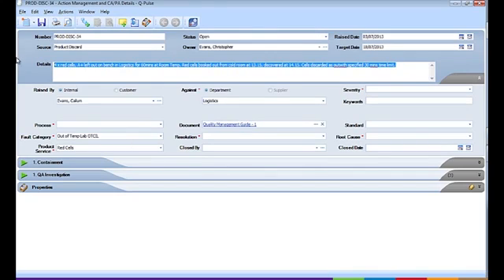Details for the initial observations are pushed through, as well as key fields for raised by, fault category, product types, and also reference documents. You can see that several fields have been marked with red asterisks, and this indicates mandatory fields again, and data must be captured in these fields prior to record closure, and the system will not allow these records to be closed without data. This again is used for analysis.